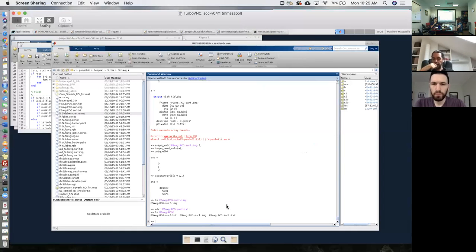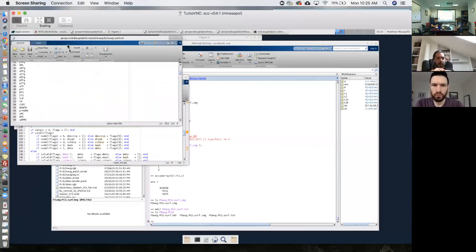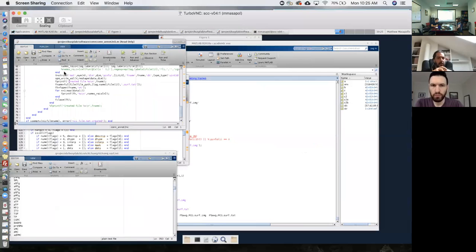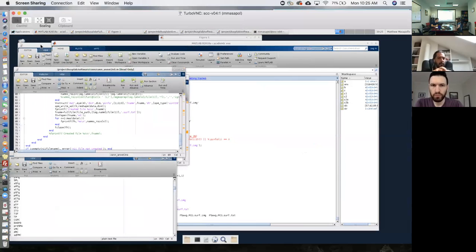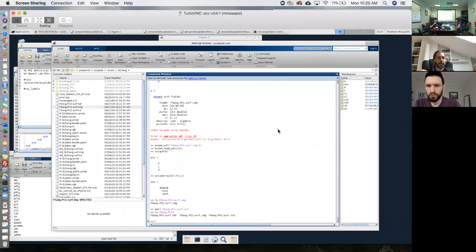So then I have to prepare an ROI config file that points to this one here before I run this? Right, or within your ROI config file, enter this as an additional ROI. You can enter multiple files or multiple ROIs within a config file, so all of them will be entered into your analysis. So when you specify the ROIs in your config file, you can just add to whatever set of ROIs you want to enter into your second analysis. So you can enter multiple lines below the ROIs field, and they will just correspond to different ROIs for that analysis. Okay, thank you very much.